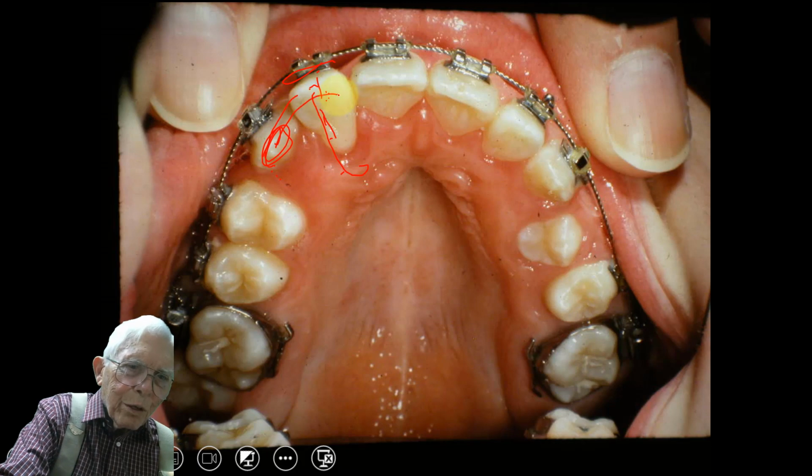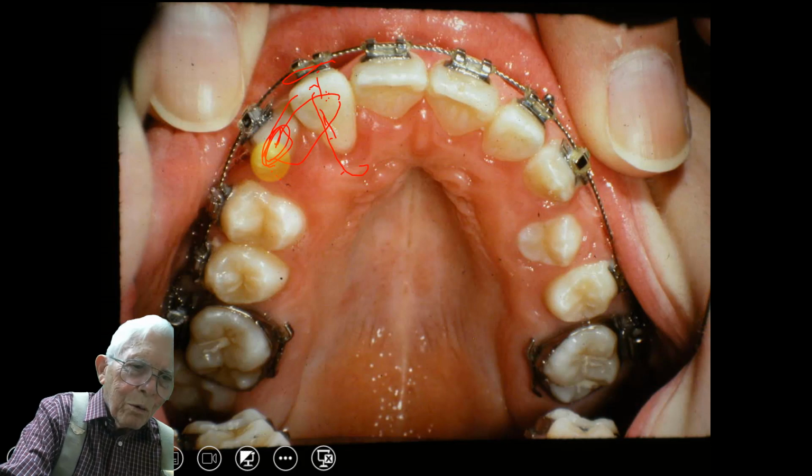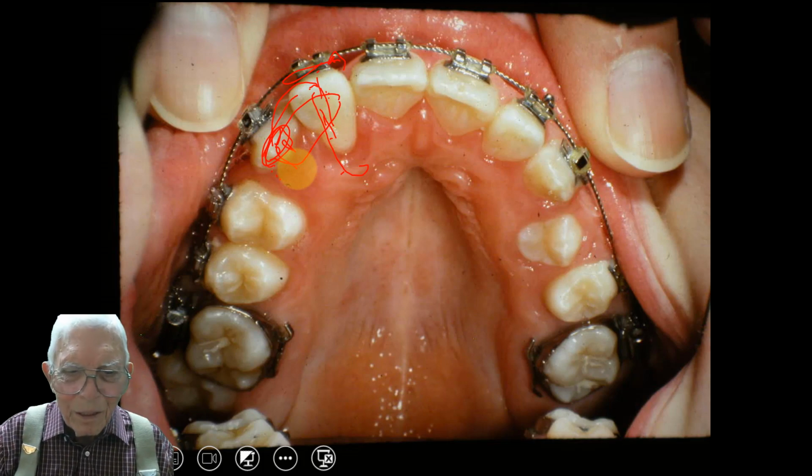Get over on the other side, then get again and pull the, what we're doing here, we've already slipped the cuspid over it. The cuspid was up here, and now we're pulling this lateral up, and this is the cuspid. I get turned around myself with what we did with the tooth.